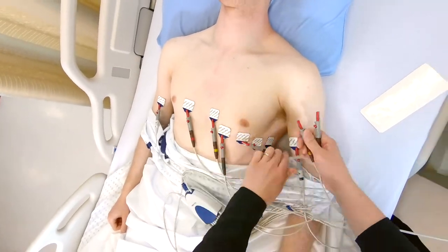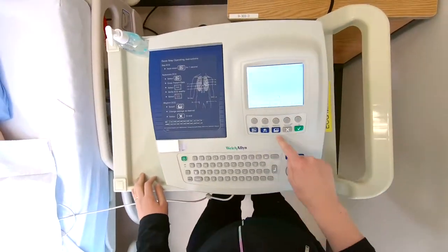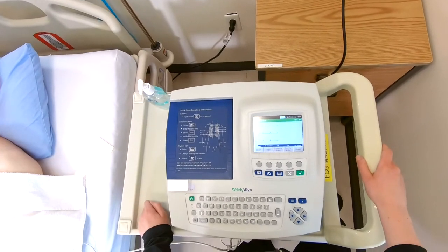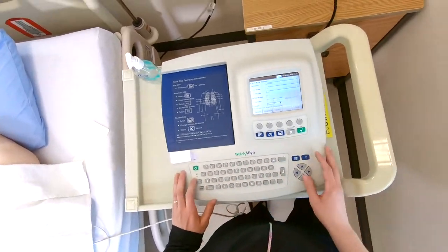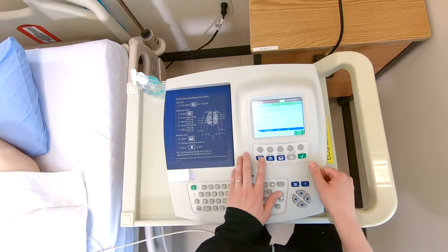Next, cover the chest to maintain patient privacy. Check the ECG settings, then enter the patient demographics in the required fields such as name, date of birth, and healthcare number. Once entered, instruct the patient to lay as still as possible. Capture the ECG by pushing record or auto-start.